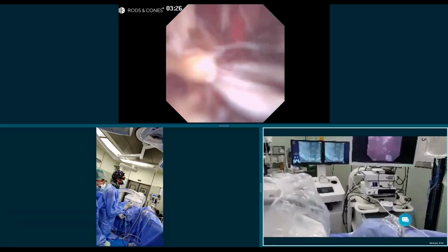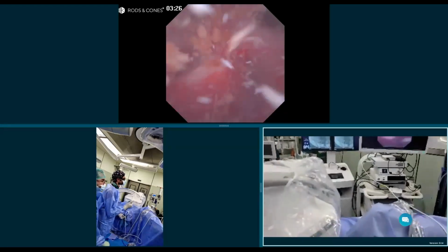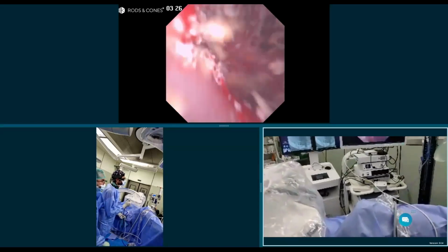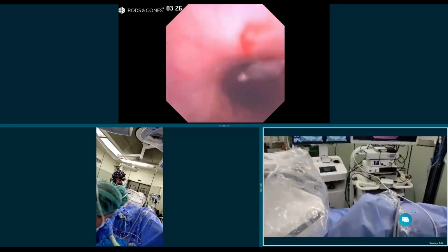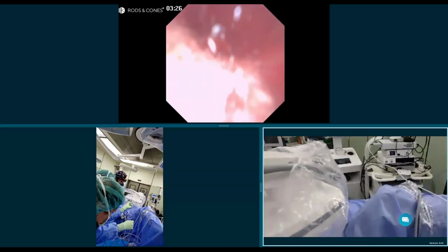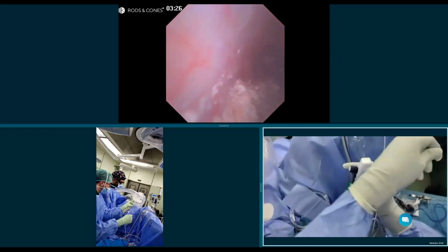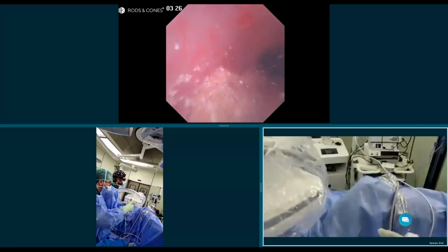This is really, these are less than, this is less than 0.2 millimeters. I'm going to dust everything here. Just dust in the upper pole. I'm going to do just a little bit of 2 seconds of dusting and I'm going to end the procedure here.